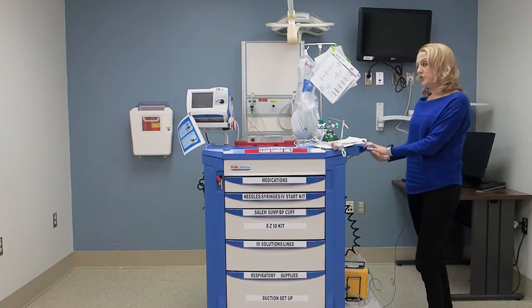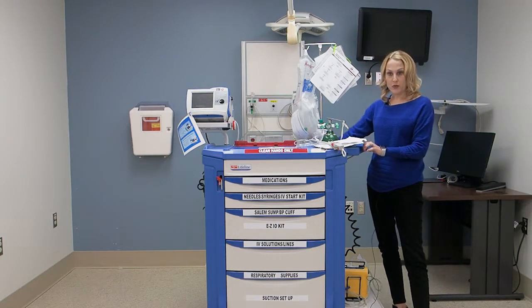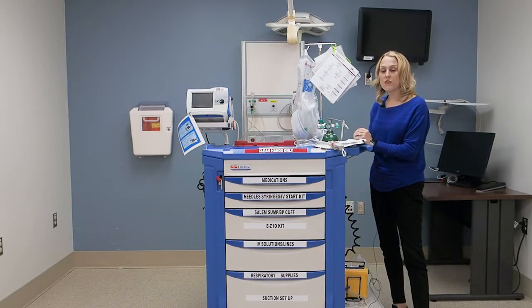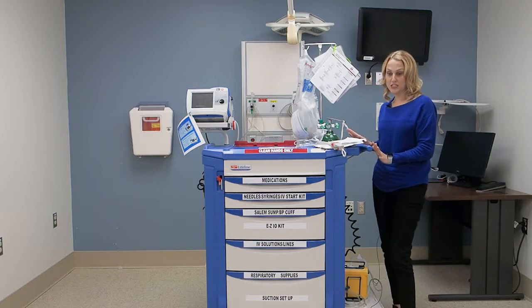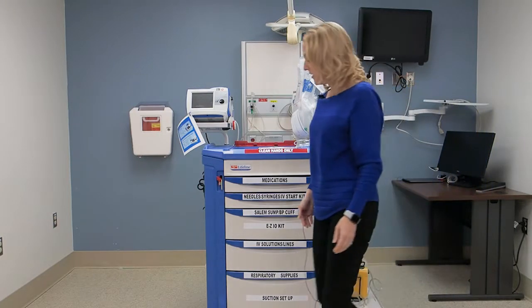While I'm here, I do want to point out on the back of our cart is the backboard. You simply remove it, it comes off, and you would put it underneath a patient if they are lying on a soft surface, and then that way the surface can be hard when you're giving chest compressions.